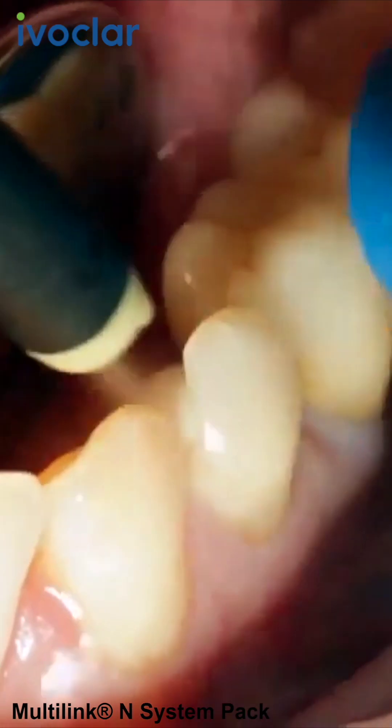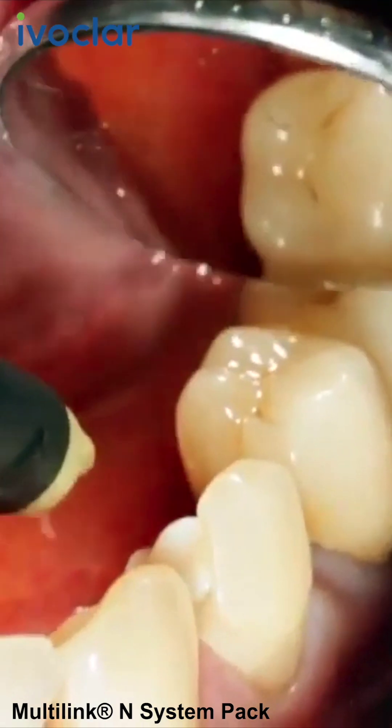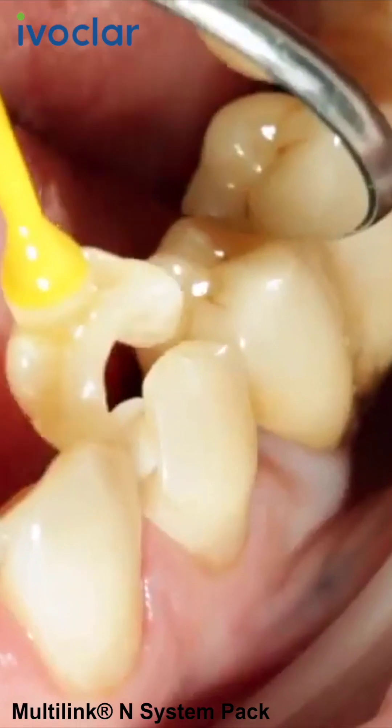Subsequently, rinse the preparation with water spray and dry it with oil- and moisture-free air. For optimum aesthetic results, check the shade of the restoration.